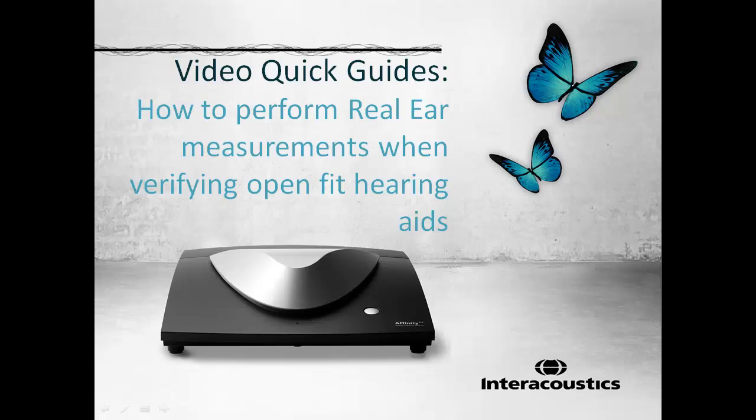This video quick guide provides an overview of how to perform real ear measurements when verifying open-fit hearing aids.